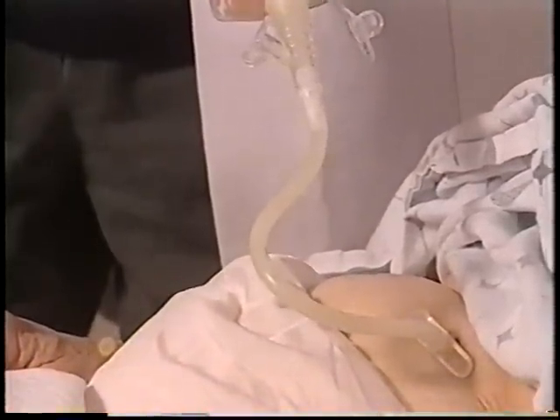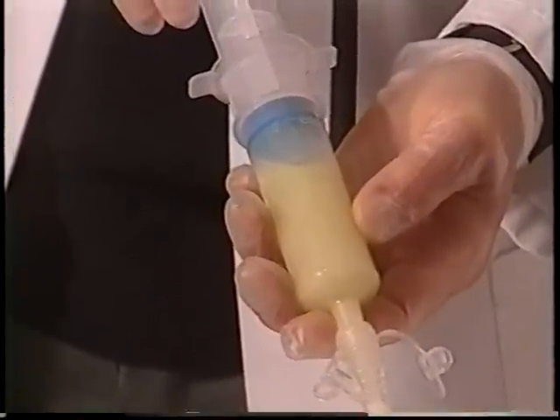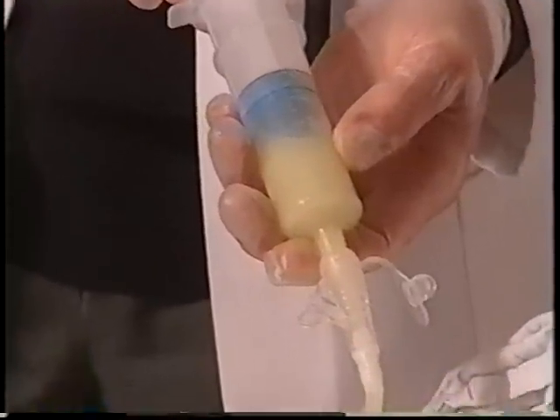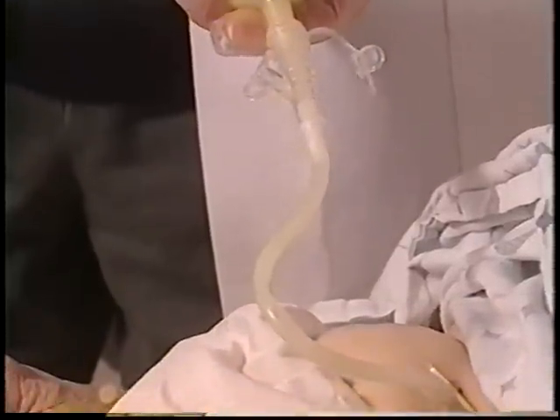If the residual amount is too high, it should be re-injected and rechecked 30 to 60 minutes later. If it remains too high, it is again re-injected and the physician notified. However, if it is within guidelines, the patient can receive their feeding.